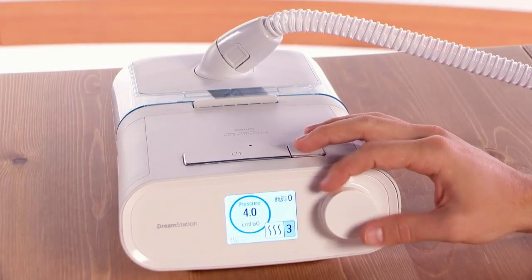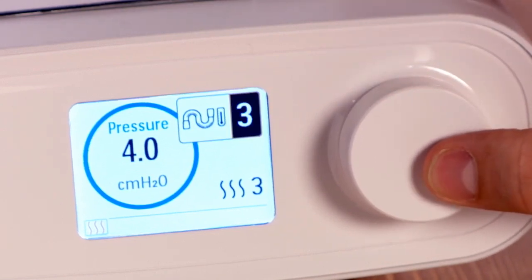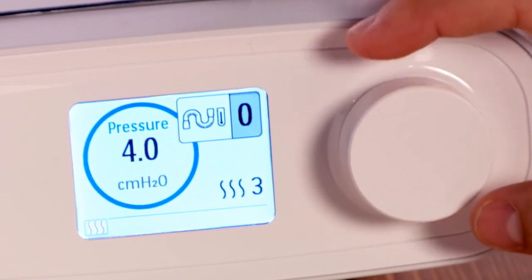If you're using a heated tube, you adjust the humidification in the same way. You can also adjust the heated tube temperature setting from 1 to 5. If you would like to turn off the heated tube, adjust your setting to 0.